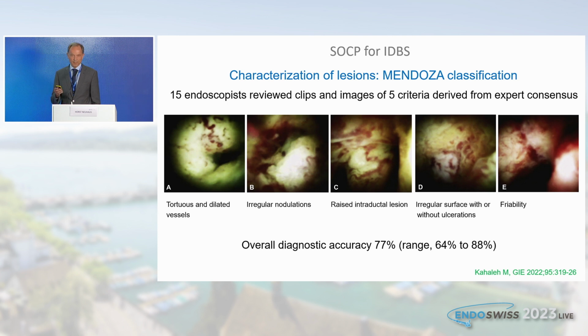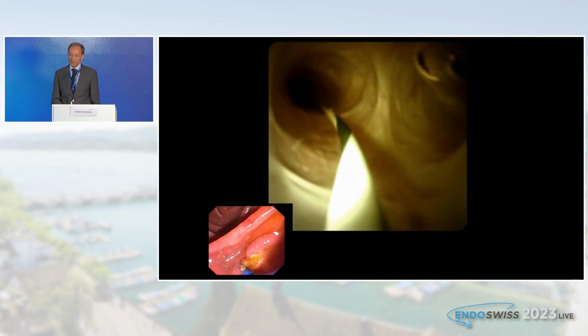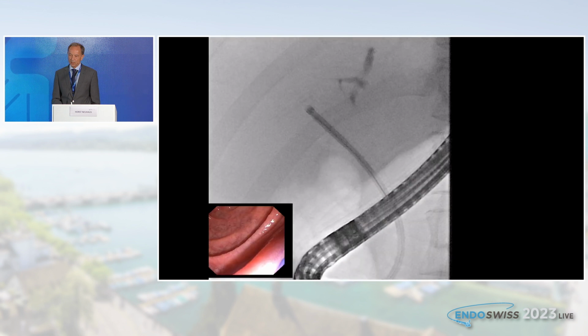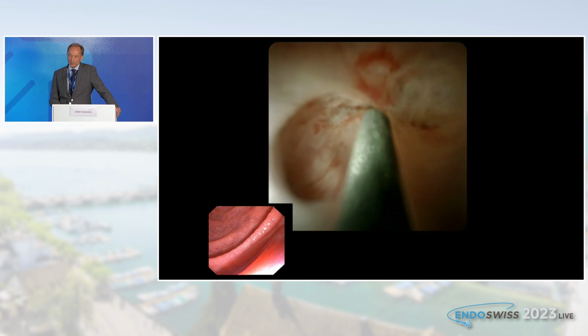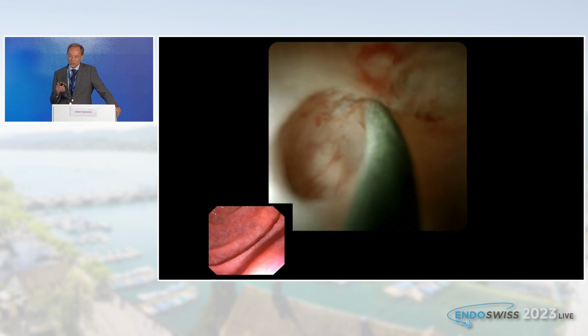So quite impressive, and in any way far better than what is shown with fluoroscopy. An example here in a patient with PSC, we are just past the confluence. There is an indeterminate stricture in the anterior lobe of the right liver. And as you can see, a very tiny stenosis. And these should be evaluated before any manipulation, as shown here.